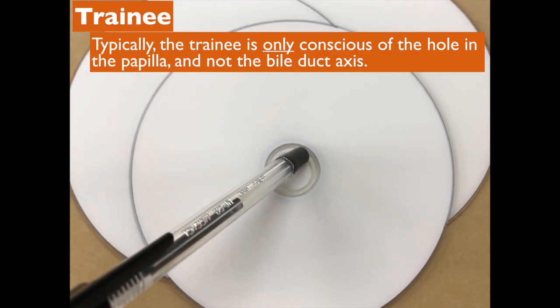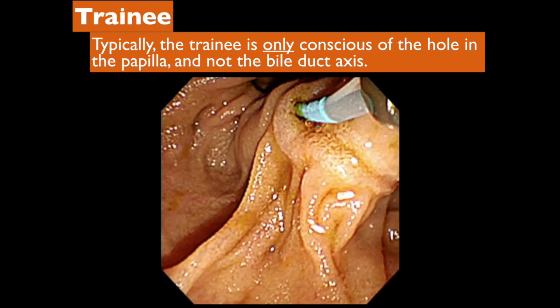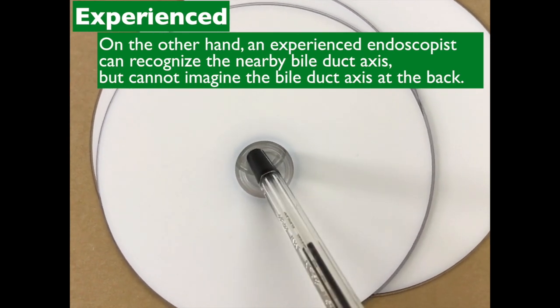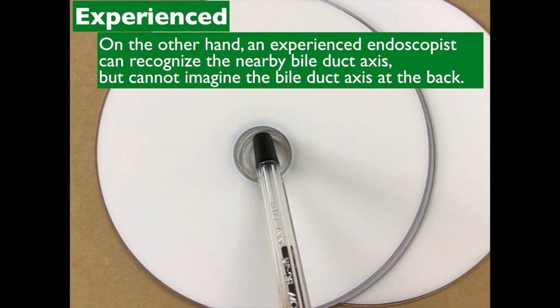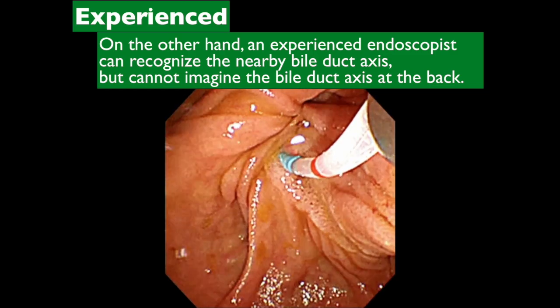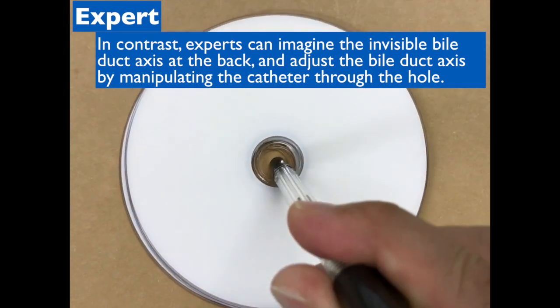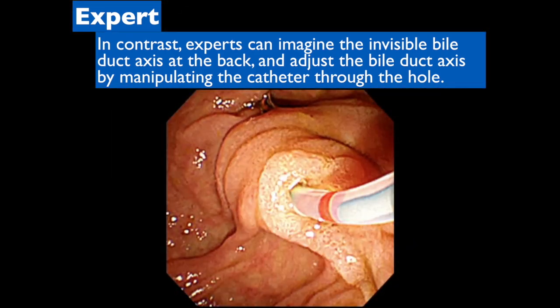Typically, the trainee is only conscious of the hole in the papilla and not the bile duct axis. On the other hand, an experienced endoscopist can recognize the nearby bile duct axis but cannot imagine the bile duct axis at the back. In contrast, experts can imagine the invisible bile duct axis at the back and adjust the bile duct axis by manipulating the catheter through the hole.